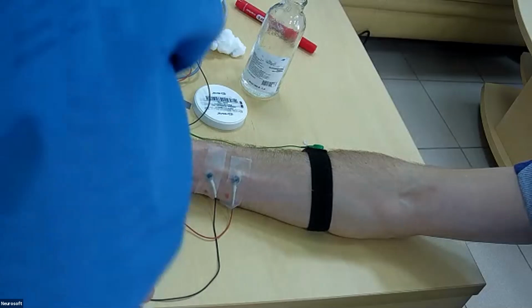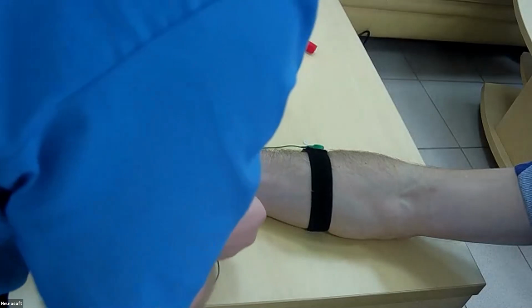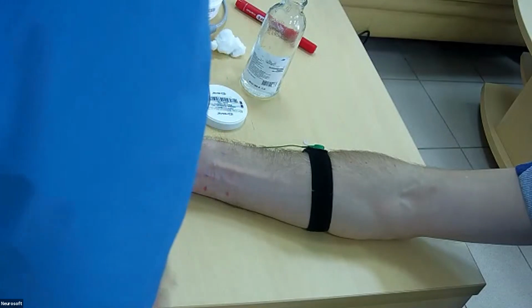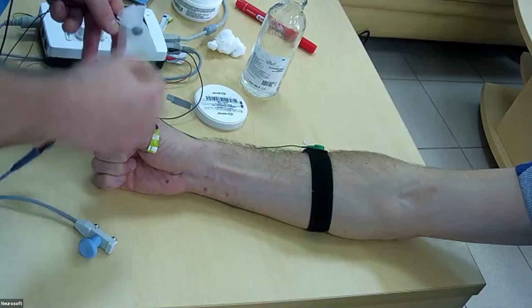Now we will do the T reflex, a standard reflex with a special electrical stimulation hammer.